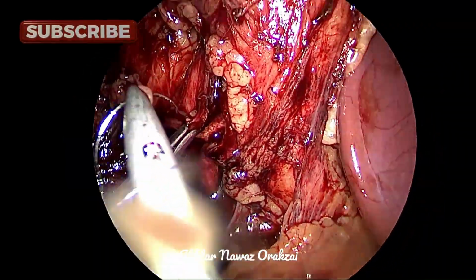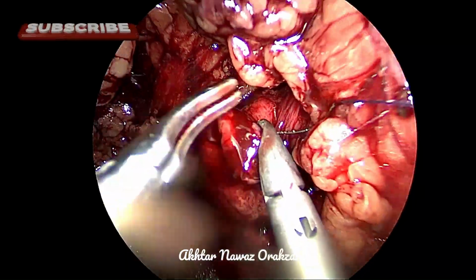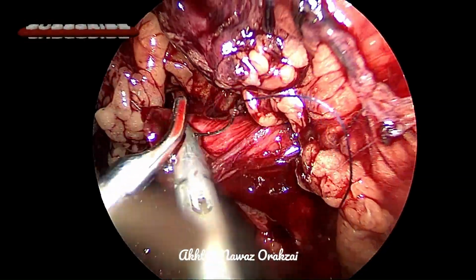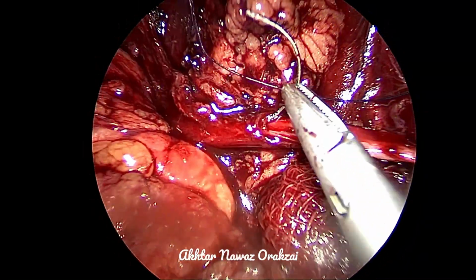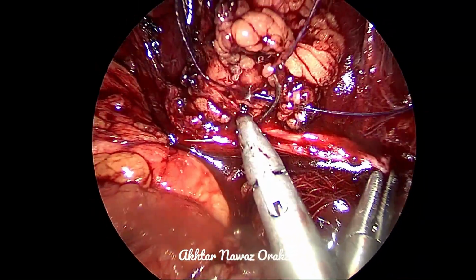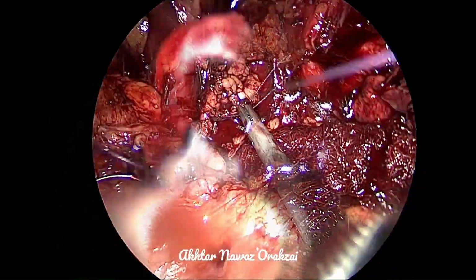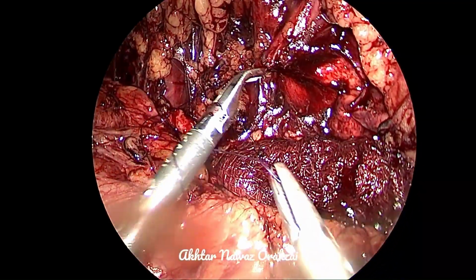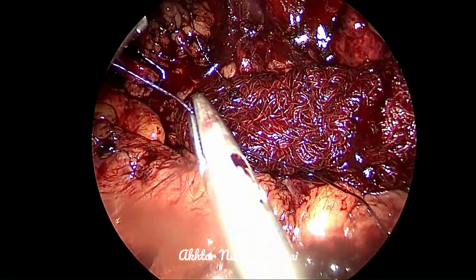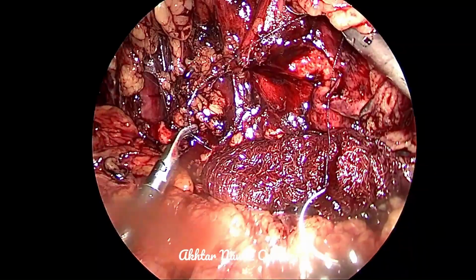And then we begin the anastomosis with the 4-0 Vicryl. So I take the stitch from the lower corner, and then from the corner of the ureter, and both can be easily approximated.